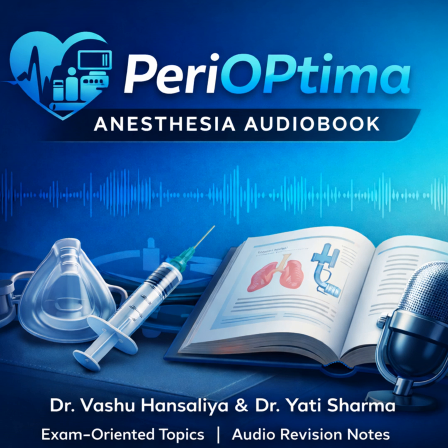And beyond just ventilation, what about the cardiovascular and neurological effects? Right. Compared to the mechanical stimulation of direct laryngoscopy and ETT insertion, SGAD insertion causes a significantly reduced hemodynamic response. So less tachycardia, less hypertension. This reduced stress response is key in patients with compromised cardiac function. Furthermore, the less invasive nature leads to less of an increase in intraocular pressure, or IOP. This is a noted benefit, particularly for devices like the iGel and LMA Supreme, which makes them excellent choices for eye surgery, where IOP fluctuation is critical.